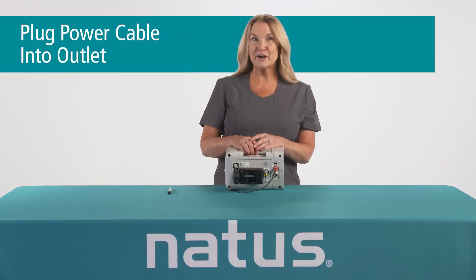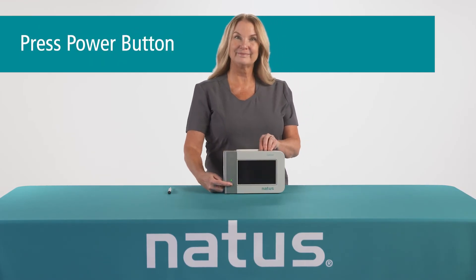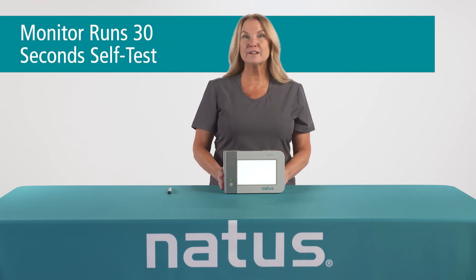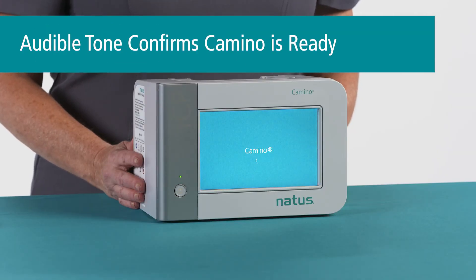Then you can plug the monitor into the wall outlet. There is one compressible button that turns the monitor on. The monitor will initiate a self-test, which takes about 30 seconds to complete. Then you'll hear an audible tone and you'll know that your Camino is ready to be used and that your speaker is working appropriately.